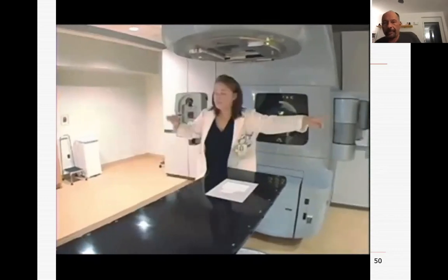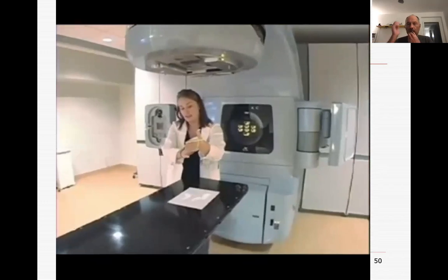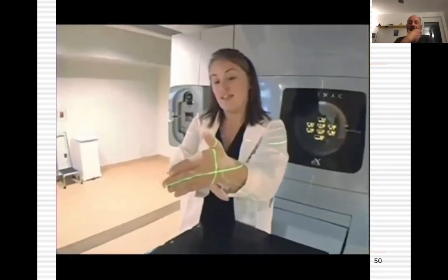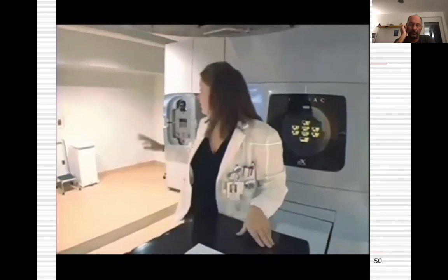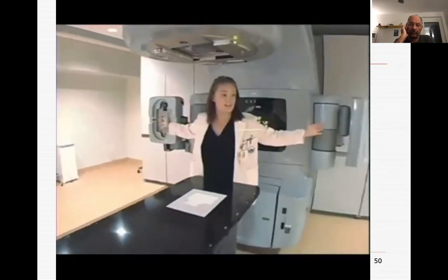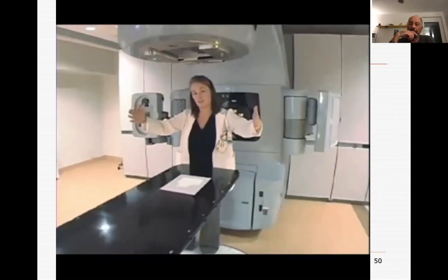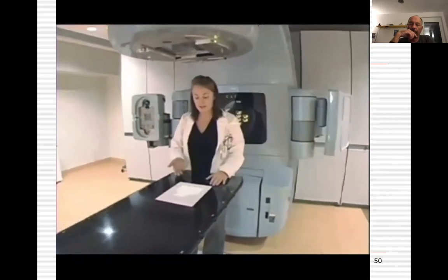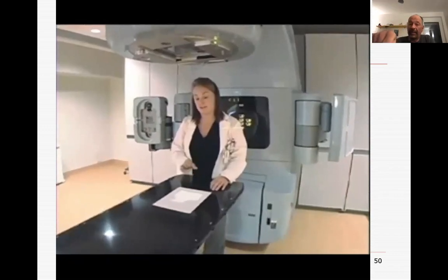And we have 2 lasers in the walls here and 1 in the ceiling. And they create sort of a crosshair, if you can see. And what we do is line the tattoos up right into the crosshair of that laser. And that ensures that the patient is in the correct position every single day. So once we have them in the perfect position, there's 2 arms on either side of the machine here that come out, and they enable us to take daily x-rays of the patient. So every day we can take an x-ray that shows us their bony anatomy, so that we know that they're in the exact same position every day for their treatment, and we know exactly what we're treating.